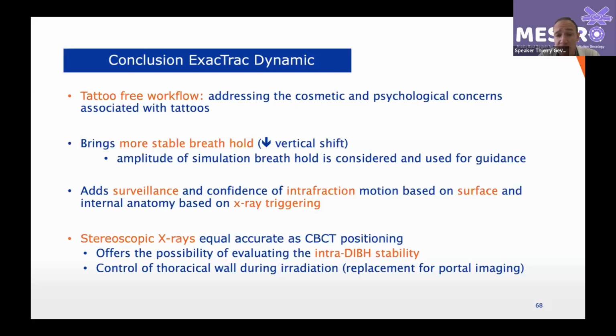And again, during treatment, you can decide: do I go with surface? Do I go with X-ray imaging? So I think it's an added benefit to have both systems so that you can play with them and have your own vision and philosophical way of applying that information during the treatment.